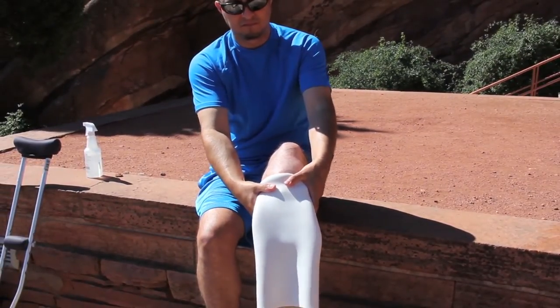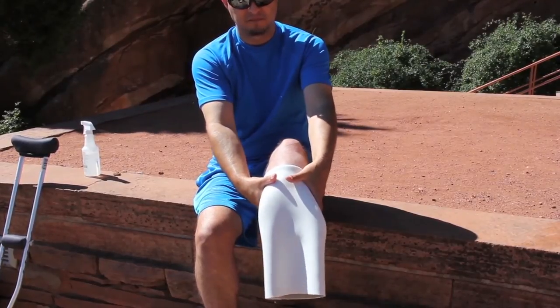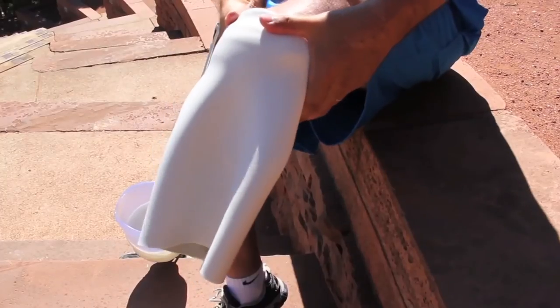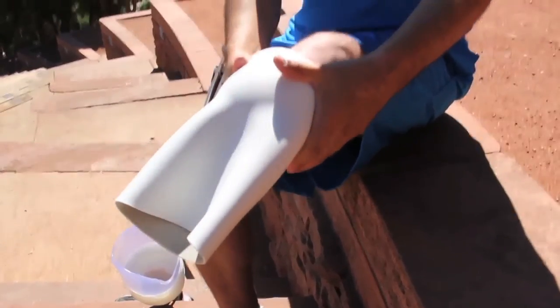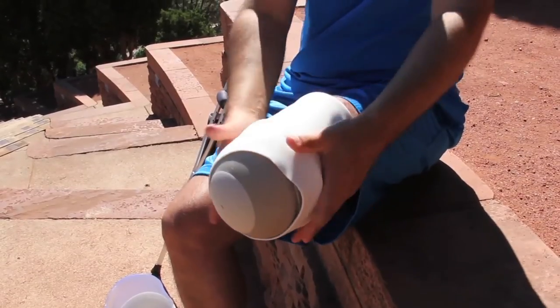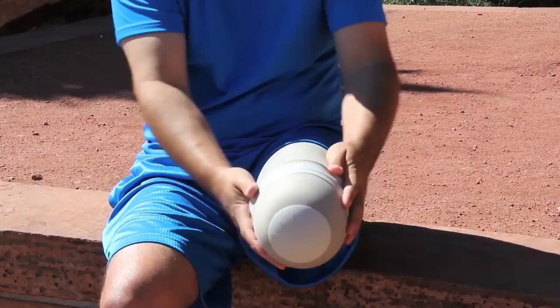If there is a pin at the end of your liner, be sure to align it properly. With light pressure, roll it up over the limb. Do not pull or tug at the liner. Make sure no air is trapped in the liner. If there is fabric on the outside of the liner, be sure not to tear it with fingernails or jewelry.